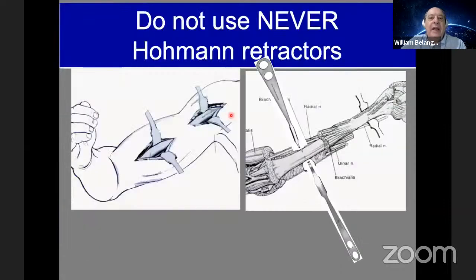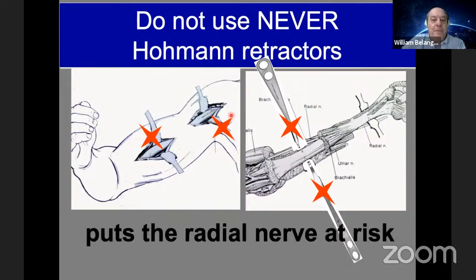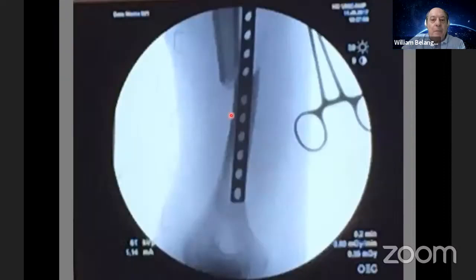Okay, it's a very important tip. Never ever use Hohmann retractors during the surgery, because you can damage your radial nerve or musculocutaneous nerve by traction. This is prohibited. Don't use it, please. Okay, this is a very important tip.